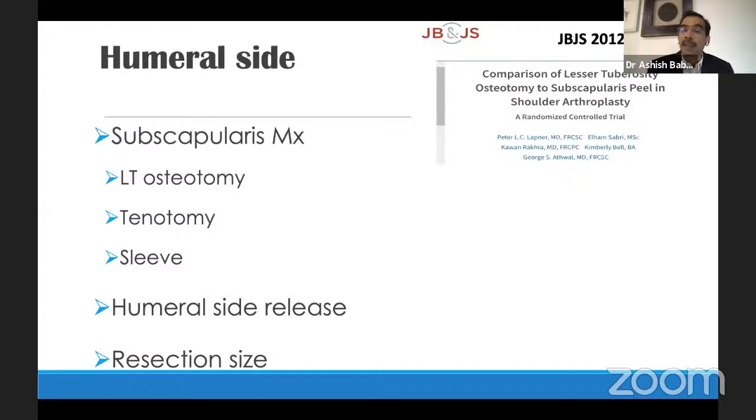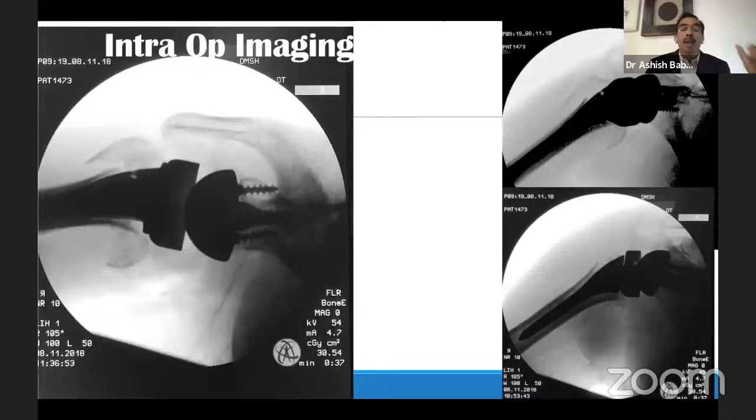Your humeral resection cut is going to dictate the glenoid exposure. So be firmly sure, and I base that on my pre-op planning. So it's not a fixed cut for every patient. I have no shame in saying that I use the C-arm imaging very frequently during my surgeries, unless it's a very straightforward, simple case. And this is a four-part fracture case. And if you look at the top diagram here, you can see the lesser tuberosity and greater tuberosity are floating up here, even on the axials.